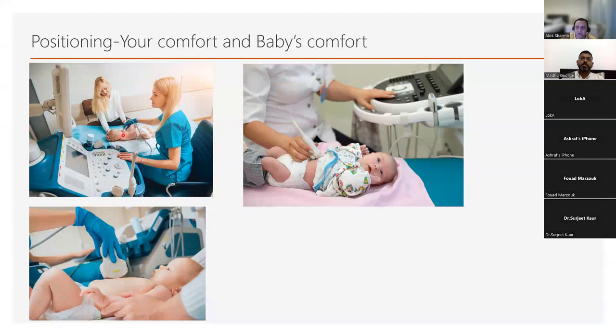To get into the right upper region and the left upper region, you will have to lift this arm and abduct it. And unless you do that, you will not get good quality images. As I will show you in coming weeks, often the images get cut. You miss the right apex, you miss the left apex. Now the right apex is very important.